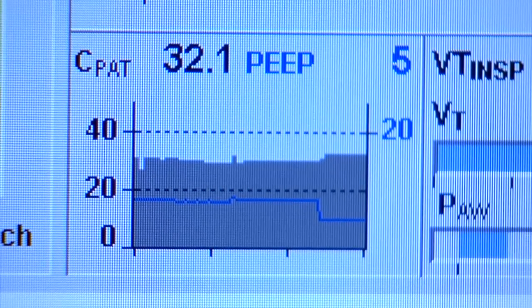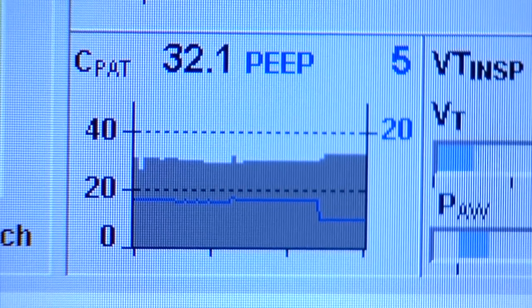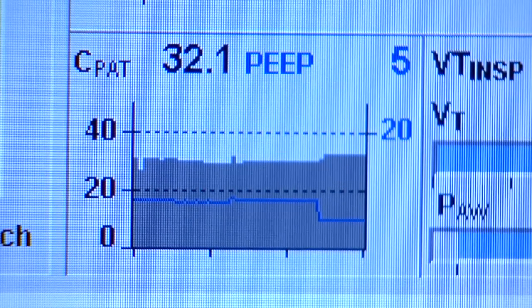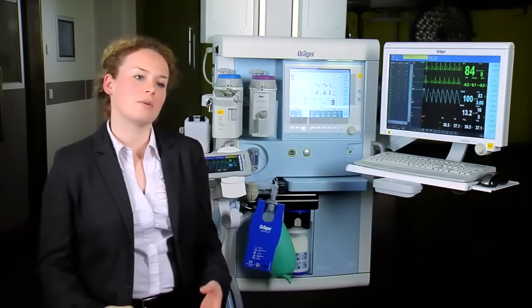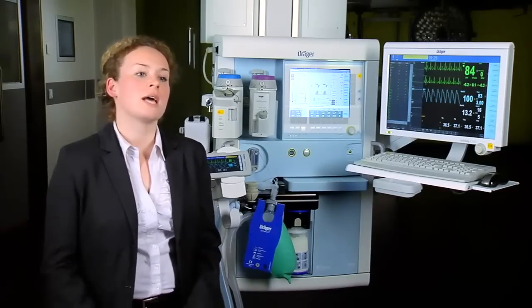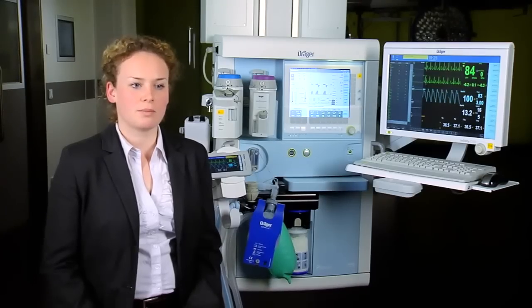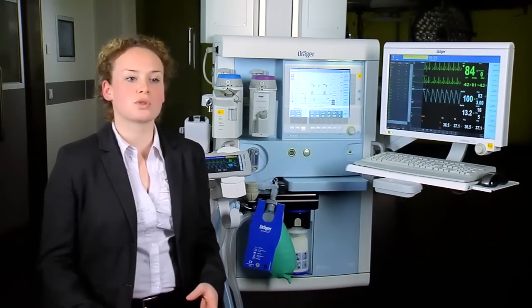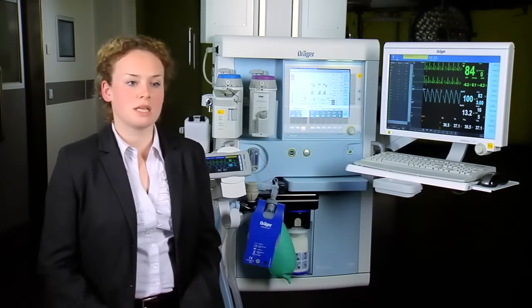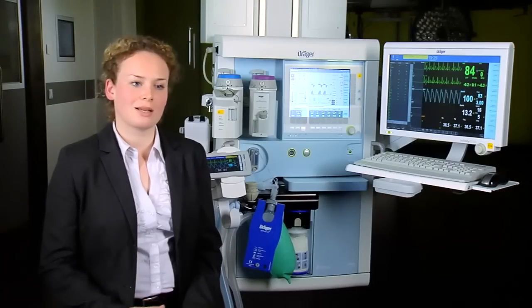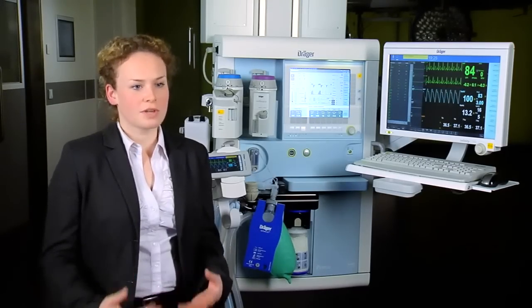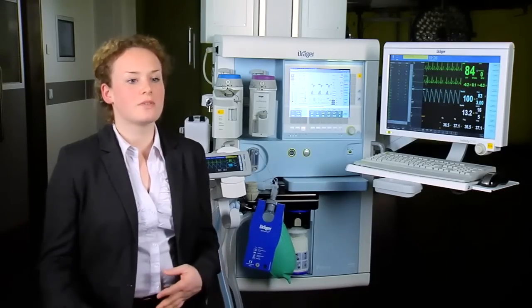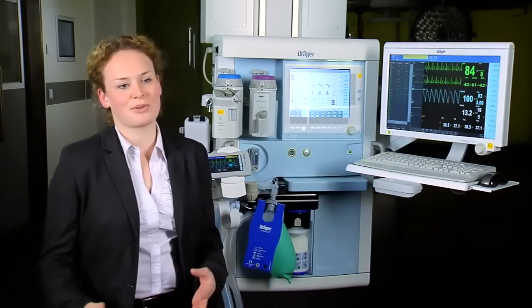We also offer additional parameters in the trend display: minute volume CO2, oxygen consumption, and the combination of dynamic patient compliance with PEEP. You can see these in the total trend display, but also in a 15-minute mini trend directly on screen. With these functionalities, we believe we bring transparency into ventilation and lung recruitment.